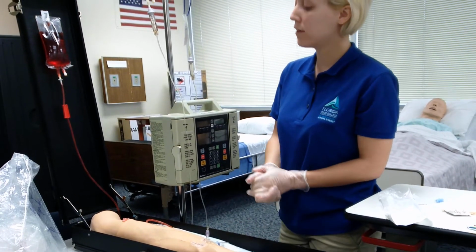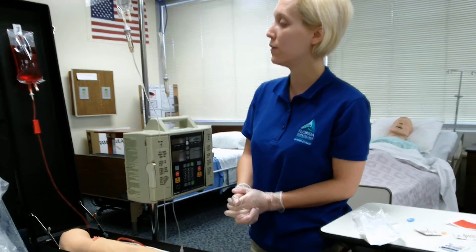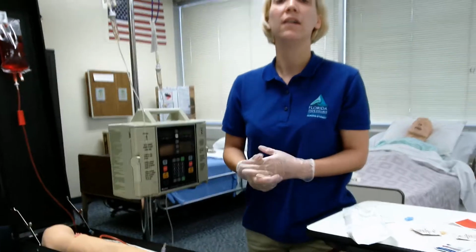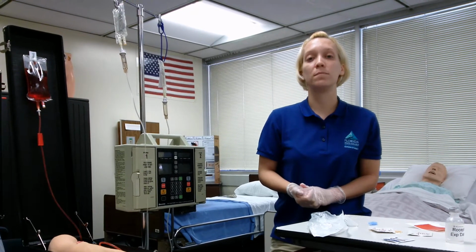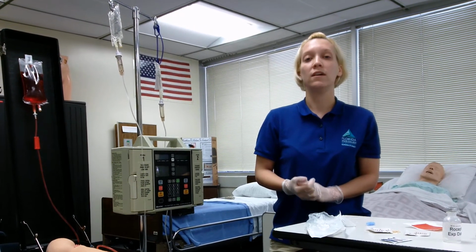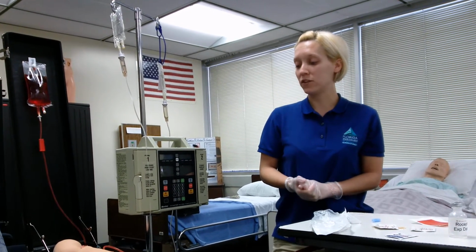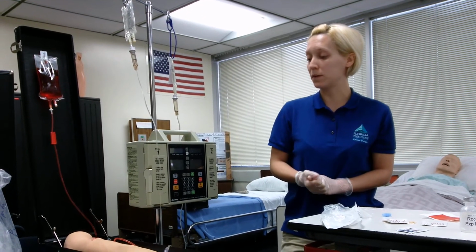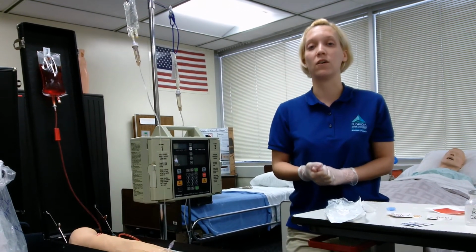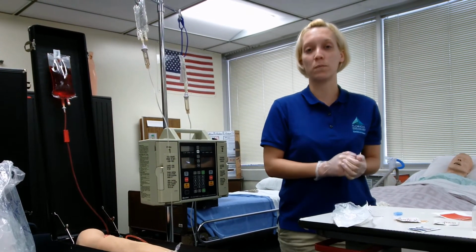So we got that all set up, Mrs. Jones. I'm going to come back in 30 minutes. I want you to call me if you have any pain. I will come back and check for any allergic reaction. I'm going to document the procedure, the medication dose, frequency, route, my name, patient's name and date of birth, any allergies. I'm going to document the procedure, how they tolerated it, and also any patient teaching. So now I'm going to take off my gloves and wash my hands.